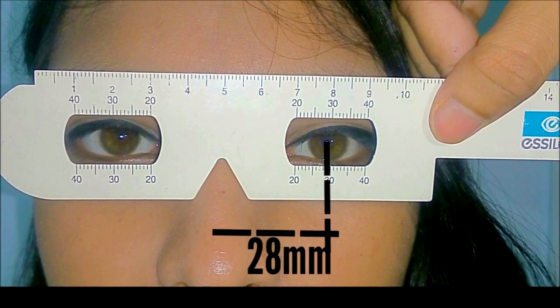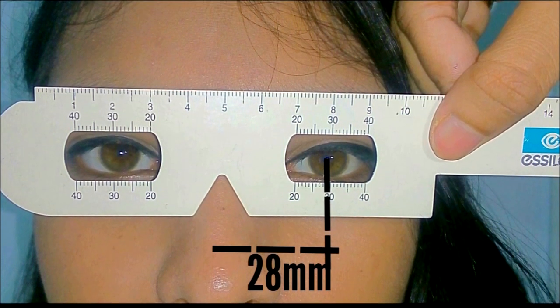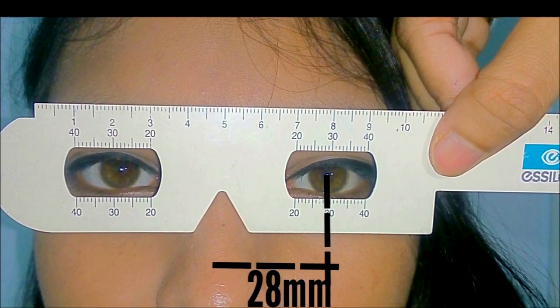Without moving the PD ruler, the examiner switches their open eye — closing their left eye and using their open right eye to look into the patient's left eye directly opposite. Again, make sure the patient looks directly into the examiner's open eye. Make a mental note of the second measurement from the center of the bridge of the nose to the center of the pupil in millimeters.